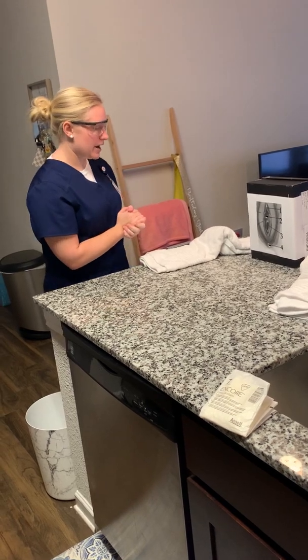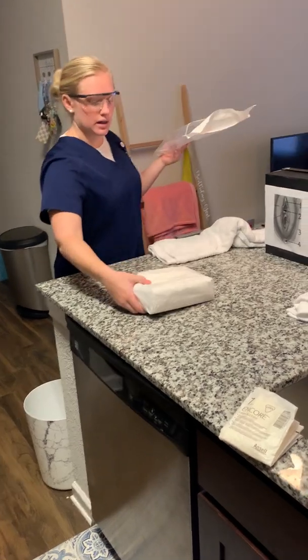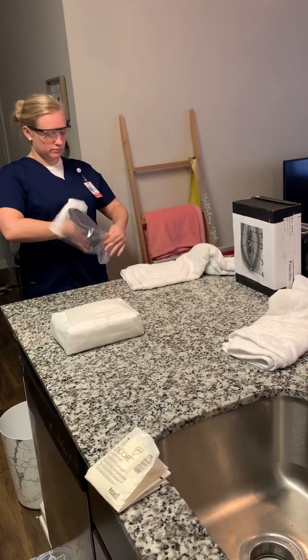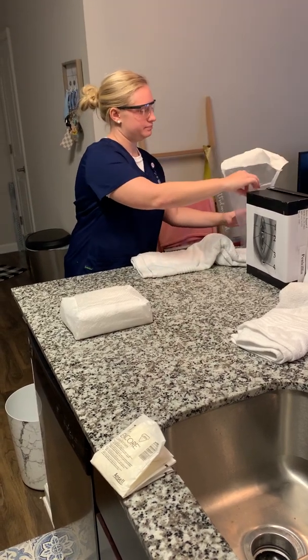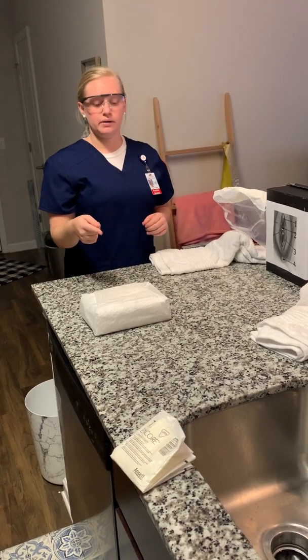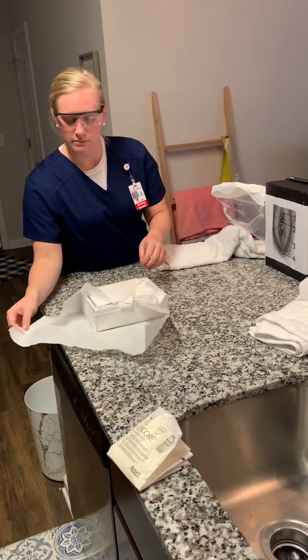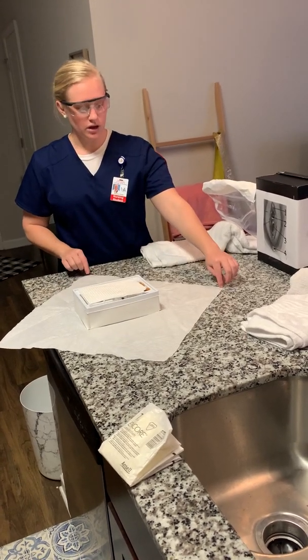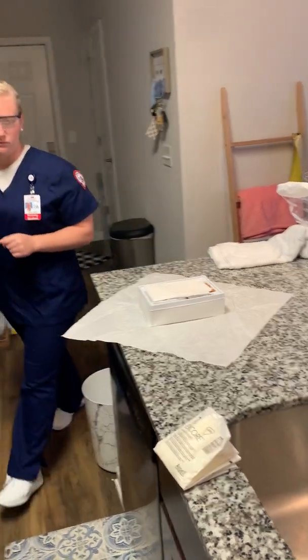So after I perform perineal care, I'm going to open my kit. So I'm going to lay my kit like this, and then I'm going to use this as a trash bag. I'm going to put it at my patient's hip. Okay, and then I'm going to open my sterile field. I want to open it away from me, and minding the 1-inch border. Okay, so now I'm going to remove my gloves, perform hand hygiene, and don my sterile gloves.